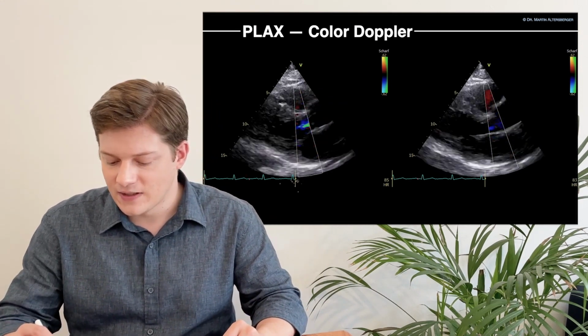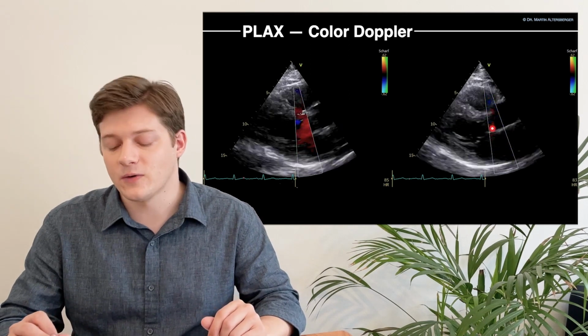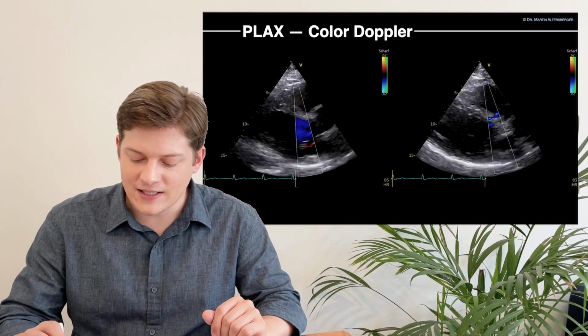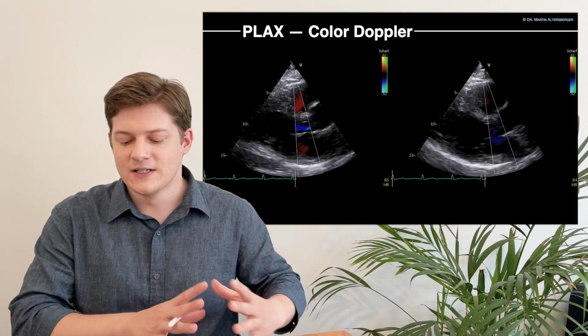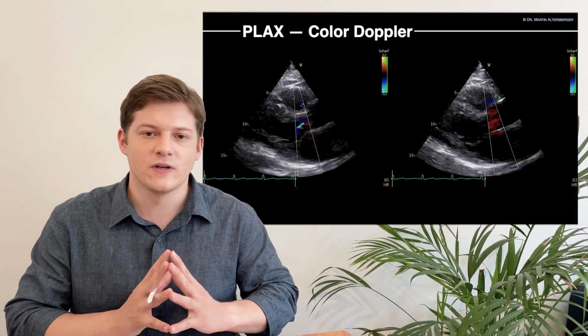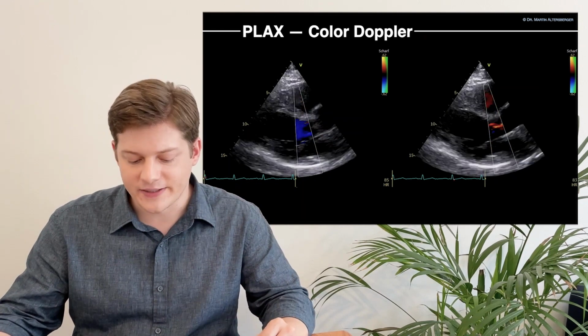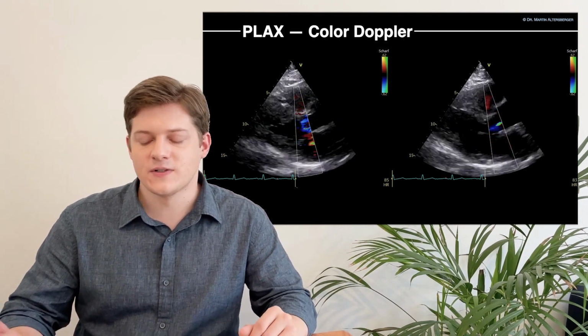Second, place it across the aortic valve. Here you see the aortic valve. Also across the aortic valve there is an insignificant jet. So you see here a tiny jet as well. Still keep it in mind to scan it in more planes. So the parasternal long axis view is also really an entire overview of all the structures you can see in the heart. So some small or minor pathologies we already found.